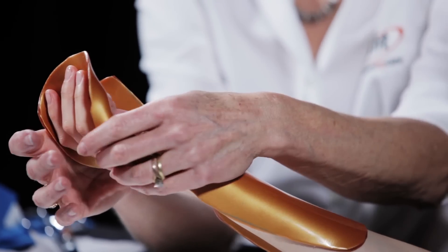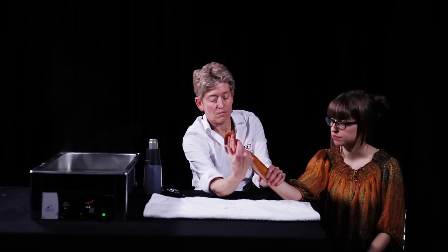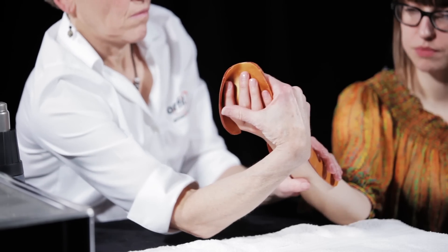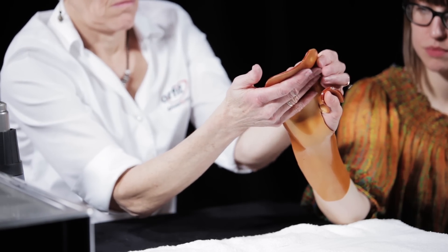Smooth the material down the forearm, stretching it slightly to help it conform. Do not pinch tightly in any one spot to avoid fingerprints and pressure points. Flip the patient's hand into pronation to check the alignment on the dorsal side.